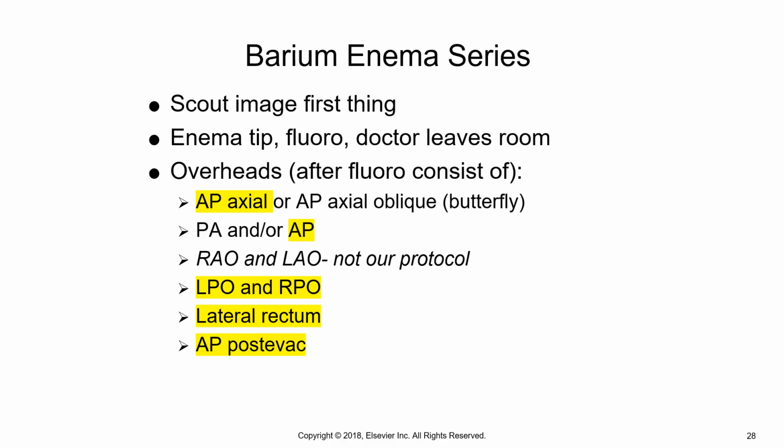is off. So when they are in the room and they tell you to have the barium start flowing, they're going to say barium on. When they say barium on, we repeat barium on once we release the hemostat or the clamp. Okay? When they say barium off, we repeat barium off and we clamp the tubing. The reason we do that is so that we can audibly respond and let the radiologist or fluoroscopist know that we heard and understood, and that's what we're doing.